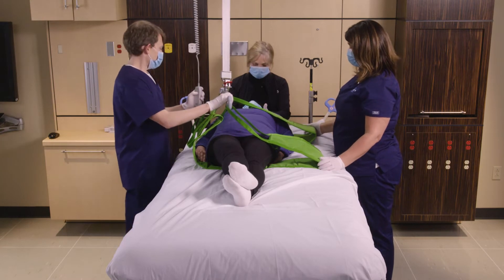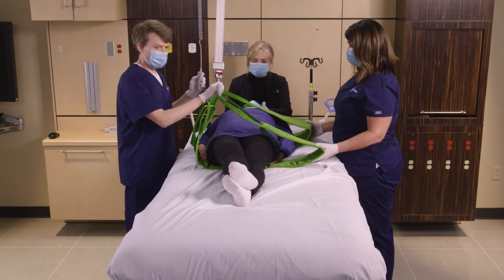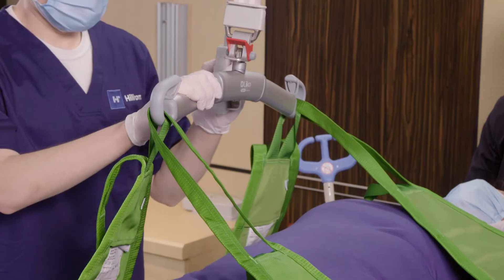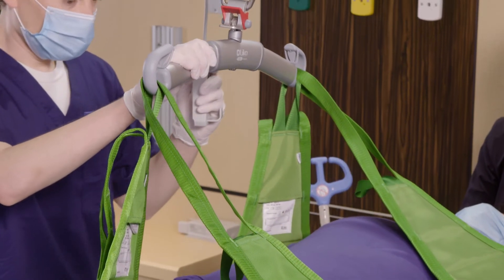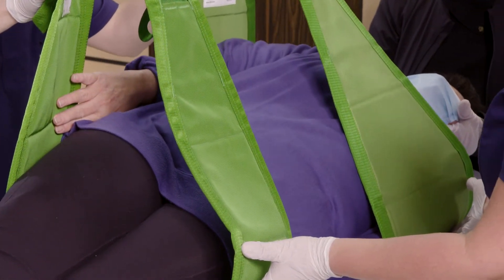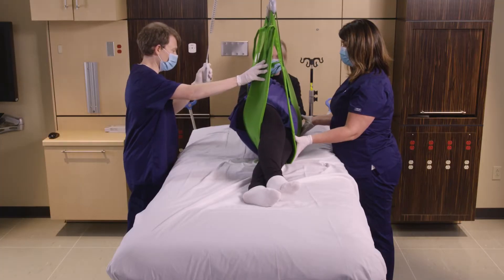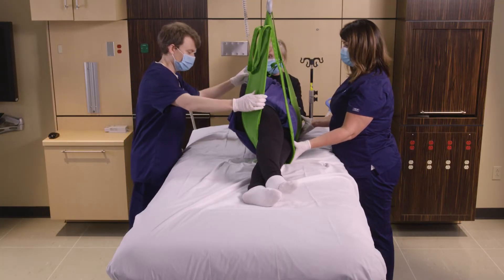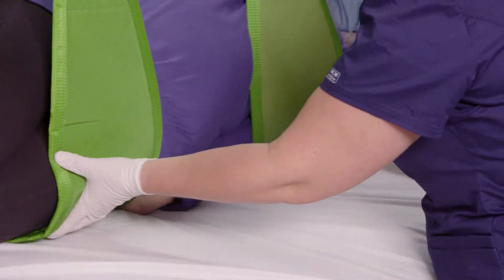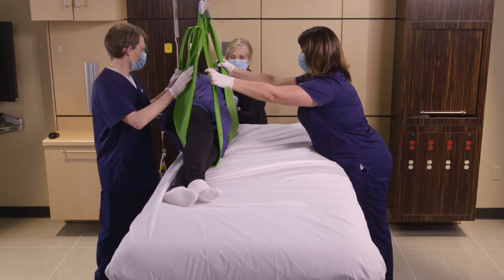When the team is ready we're going to raise the lift and the patient will begin to turn. Once the patient has turned toward the side, we're going to pause just before the patient is lifted fully off the surface, so we have some support from the surface and the patient is easier to move to the opposite side of the bed.